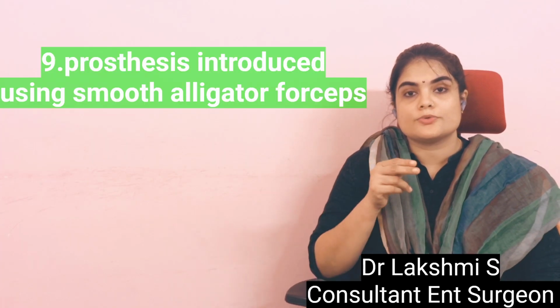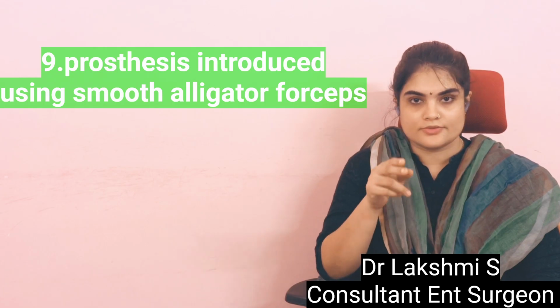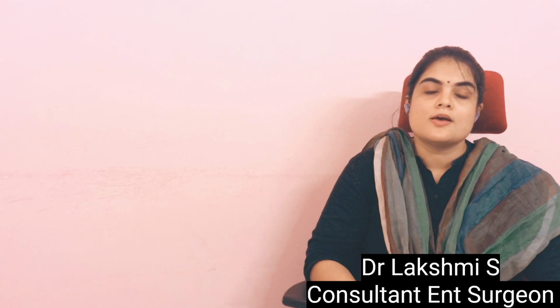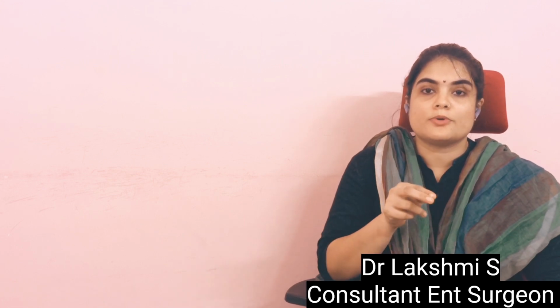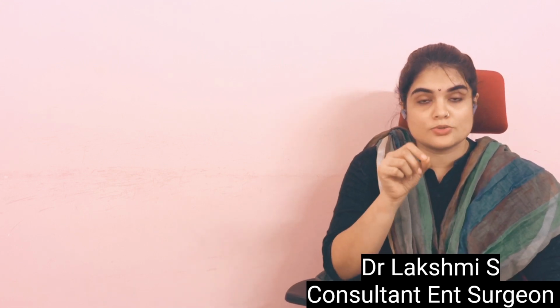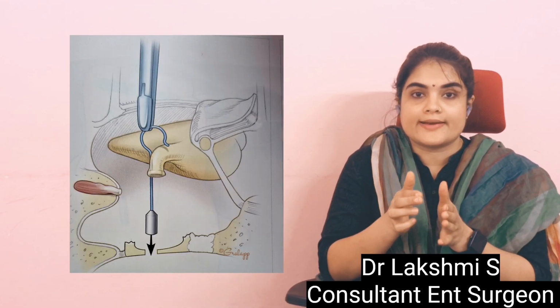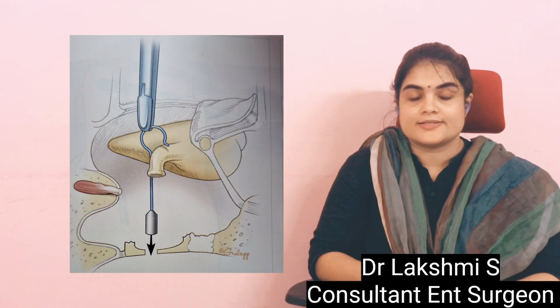The piston is introduced using a smooth alligator forceps held at the loop, and then it is introduced slowly. If in the first go itself you are not able to introduce the piston into the fenestration, you just keep it at the oval window niche and then try to slightly push it inside again.